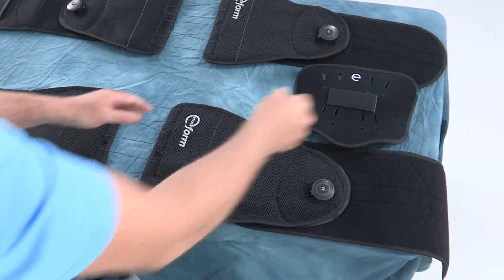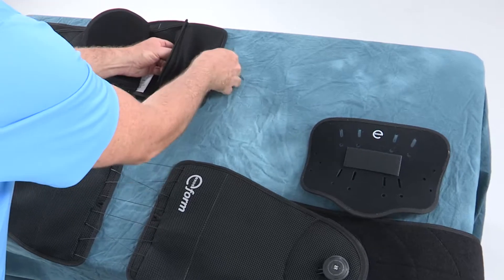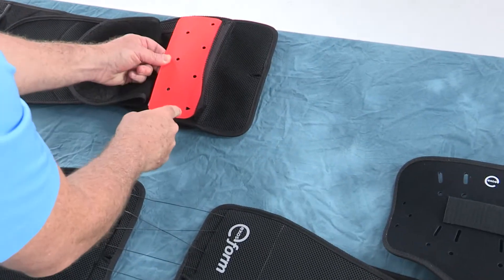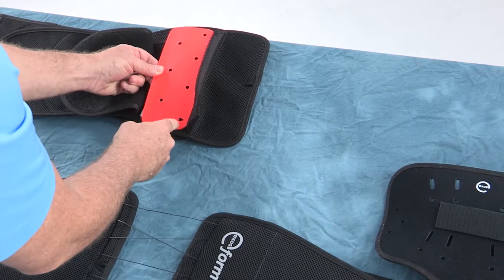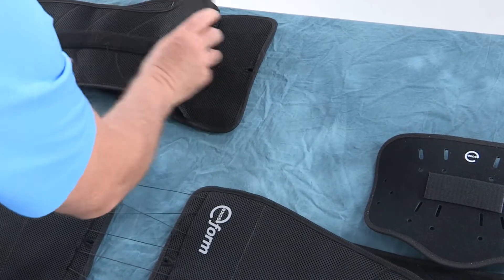The ExosForm 626 is packaged with the belt and a set of lordotic inserts that come pre-assembled in the brace pockets. The lordotic inserts are curved with the orange-colored side of the panel facing the patient. The Form 627 also includes an anterior panel.